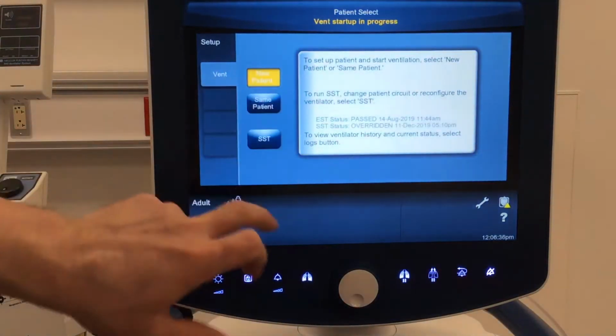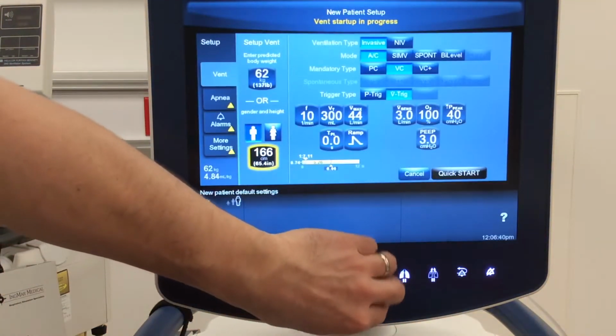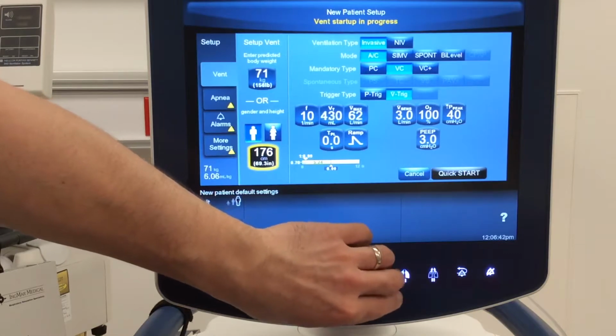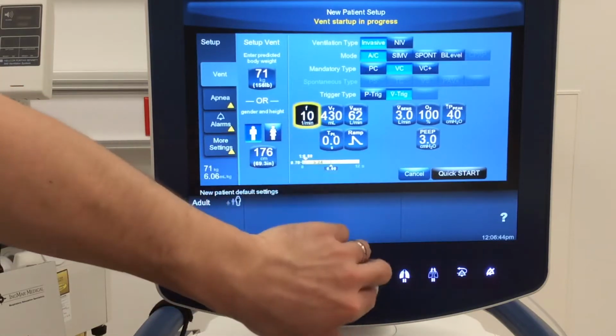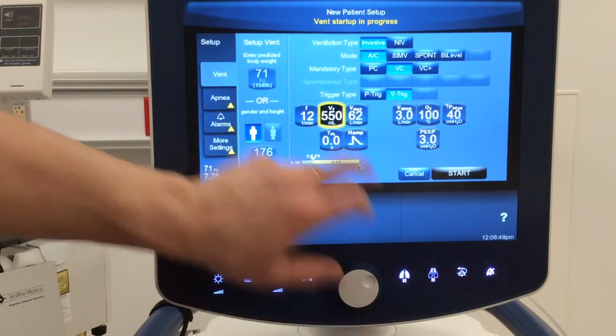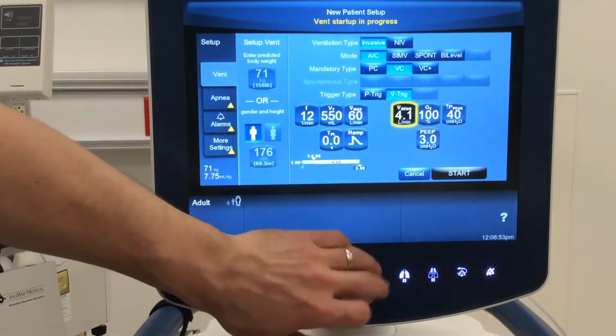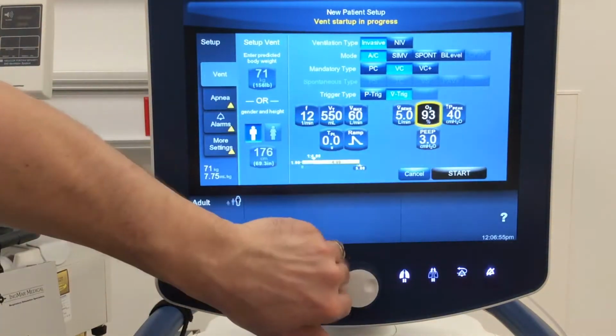So, dang it. I've never had it on that startup screen for that long before, so that should not be a problem clinically. Of course, it didn't save any of my settings, so I'm going to quickly run through all this stuff here. So 12, 550, peak flow of 60. We'll do a flow trigger of 5, 60%.